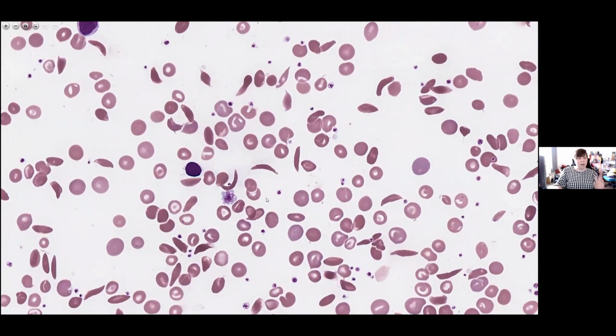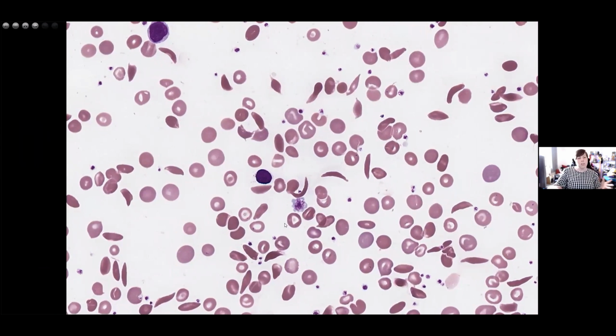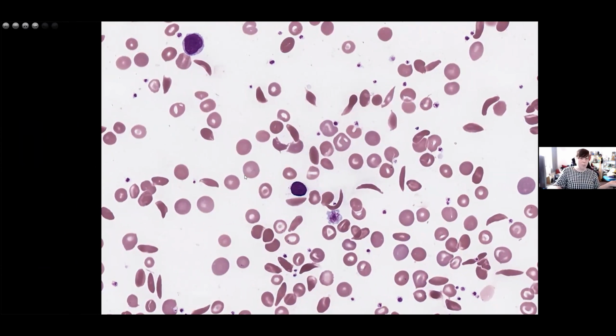Looking at the actual size of the cells, it's difficult to characterize because there's a lot going on here and it's quite a mess in general terms. But it's not a hypochromic microcytic picture. It is a hemoglobinopathy, and most of them cause hypochromic microcytic pictures, but this one does not. It's actually a hemolytic disorder, and it causes a picture that has marked poikilocytosis in terms of lots of different sizes and shapes. But the actual overall picture is not microcytic. And actually some of these are macrocytic.